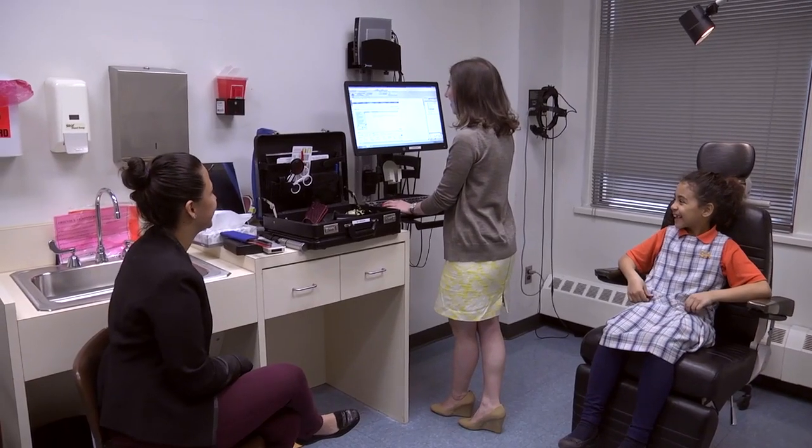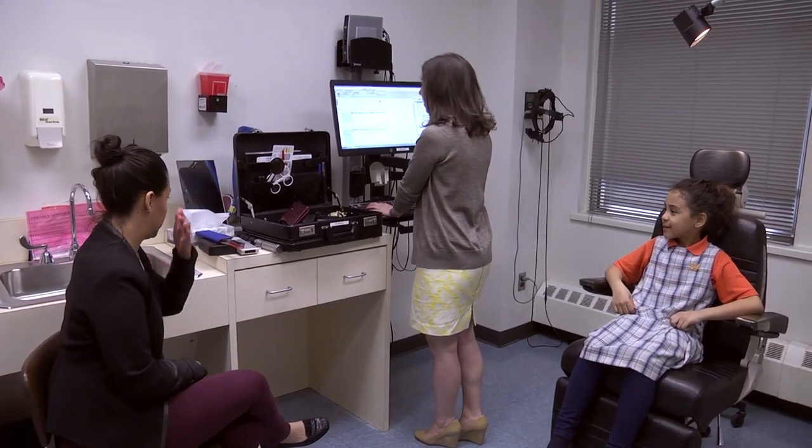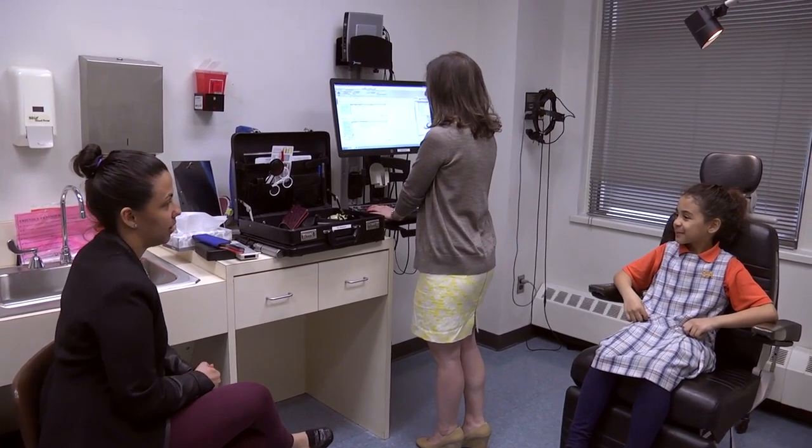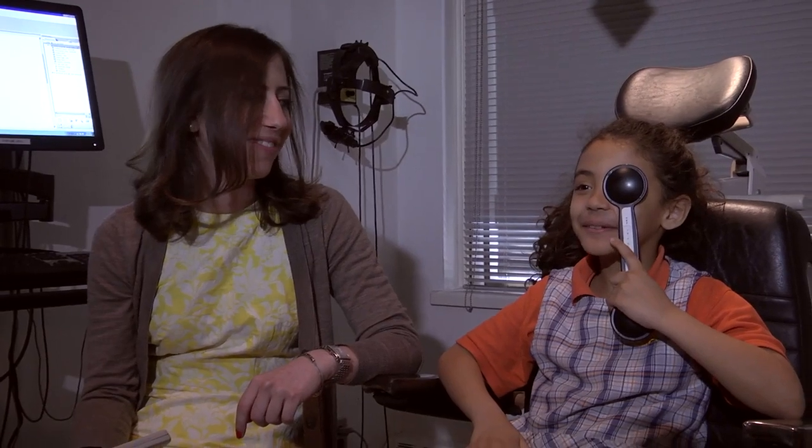We want to know why you and your child came in for the exam, what issues they may have. Did the teacher notice something? Was there a failed school screening? Any information is helpful. After we get a thorough history, we're going to check the child's vision.